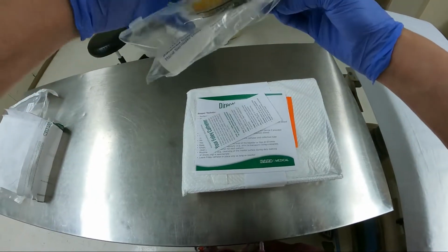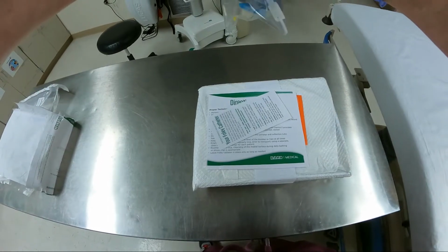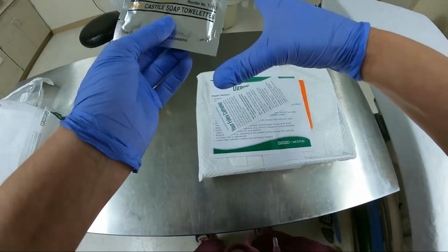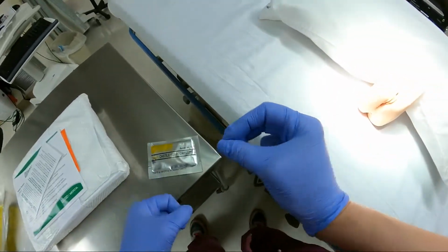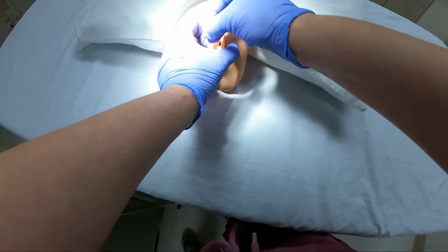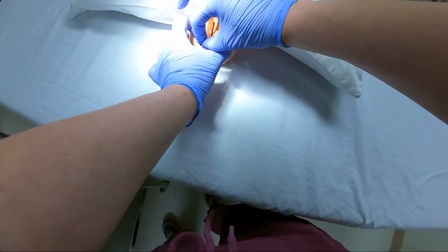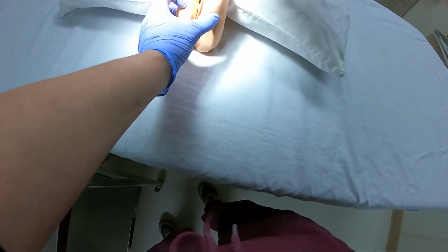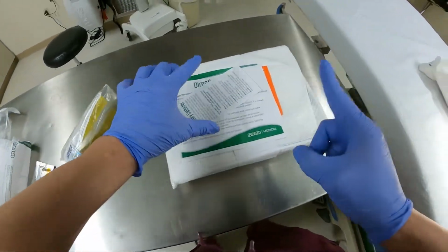Yep. So you're going to open up that packet right there, and you're going to open that pack up, and you're going to take out the towelettes, and I think there's three of them in there. You're going to use all three. You're going to take your towelette and make sure that you get the whole area clean. Throw that away. You get another towelette. You're going to clean down here to make sure you don't have any E. coli in the area. Throw that away. Third one down, done. So then we take off our gloves, wash our hands again, put on your gloves.